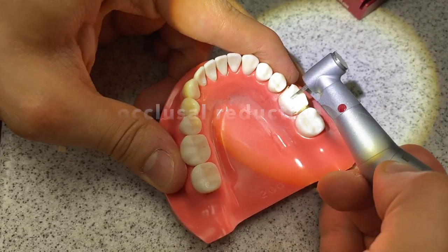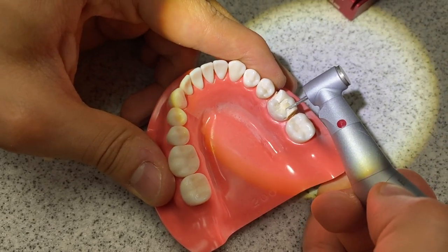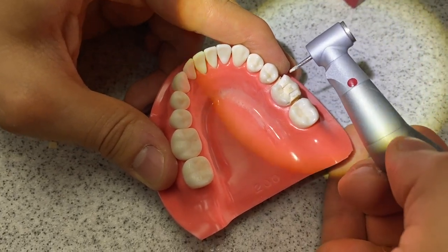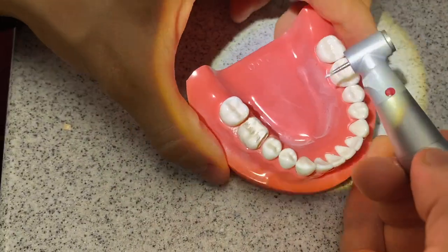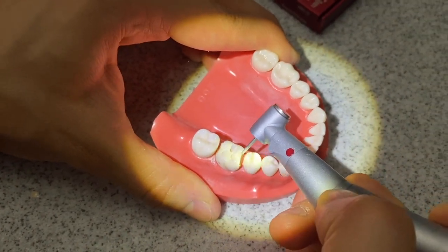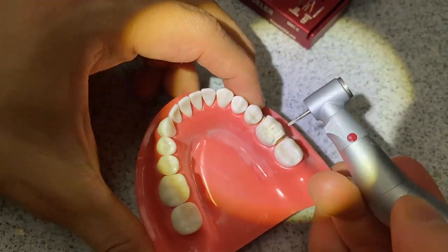As you can see — full length of the burr — the burr is exactly one millimeter in width, so I know that I at least have one millimeter reduction there. I'm going to smooth the rest of these cusps out to maintain my occlusal anatomy and ensure I have at least one millimeter reduction. Next I'm going to move on to the lingual depth grooves and depth cuts. Once I have my buccal and lingual depth cuts, I'm going to go ahead and smooth them out.